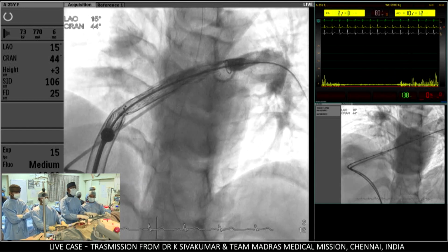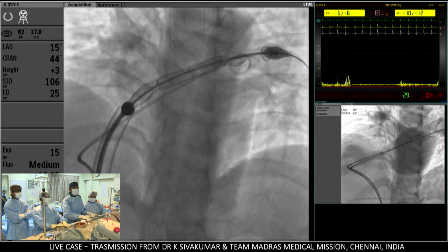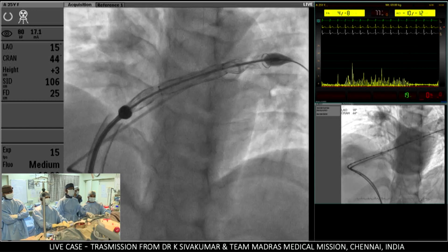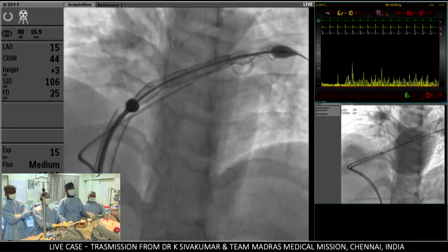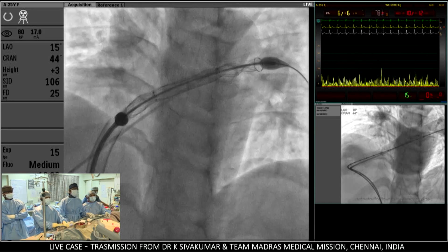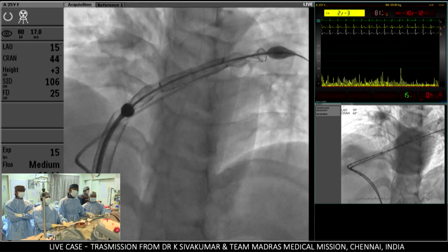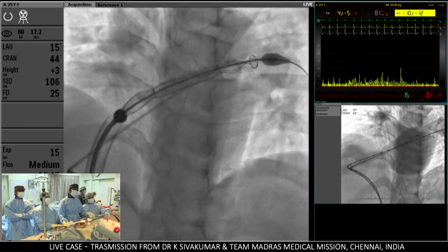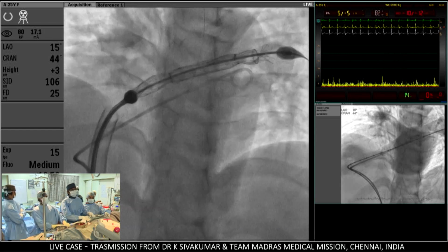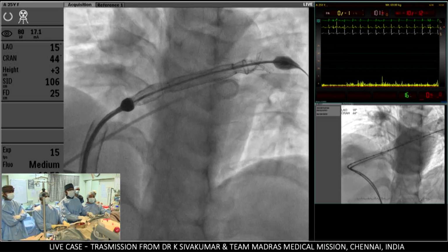Shiva, I came late, sorry for that, but it's quite challenging. And CC is sitting with me, by the way. So the plan, I totally agree with Mario that we will go to the long waist, which will hold the valve. I'm not sure about the size because I didn't come early, but 30, 32 should be reasonable. The challenge will be, we may try to open more flare, distal flare, a bit more distal, and then try to pull back. That will give us room for moving downward. So that's probably my thought at the moment.